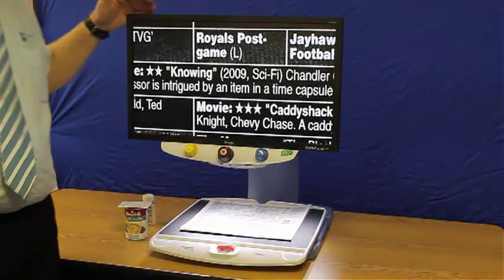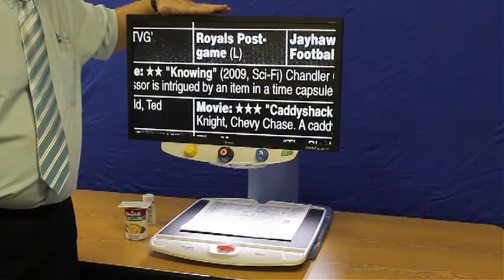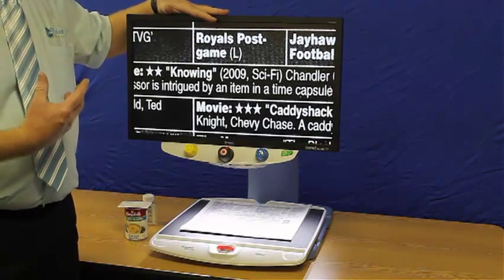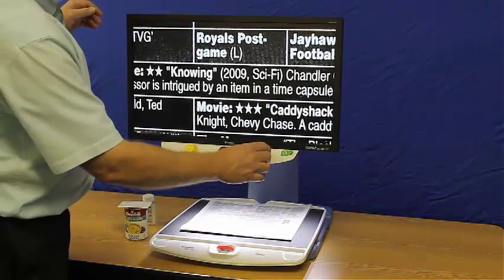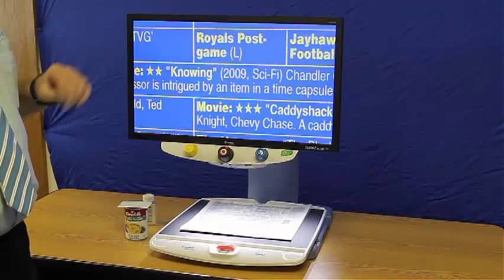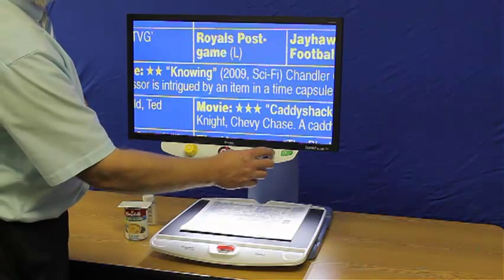Now this can be a lot easier on your eyes if you read a lot, because this screen actually is like a light bulb. The more white, the more light coming at you. So the less light we have, the easier it's going to be on your eyes. Some people find colors make a difference. So we have a total of about 30 different colors that we can program for you to use if you find one that works better or the other.